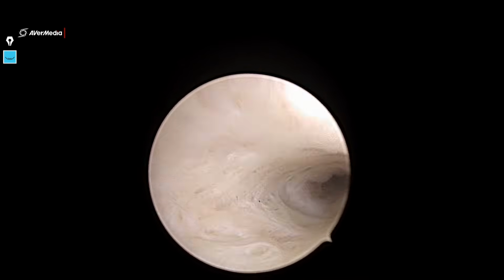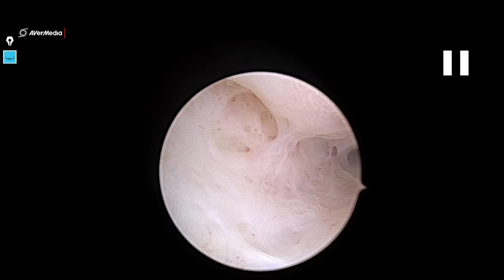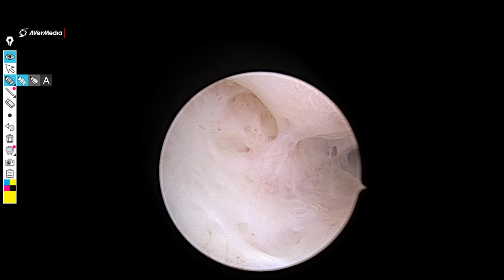The incidence of intrauterine synechiae is on the rise these days because of multiple prior surgical terminations of pregnancies, or MTPs as we call it. And I think this is a very worrying trend because, as you will see in this case, it does lead to a lot of issues that become very difficult to manage later on.